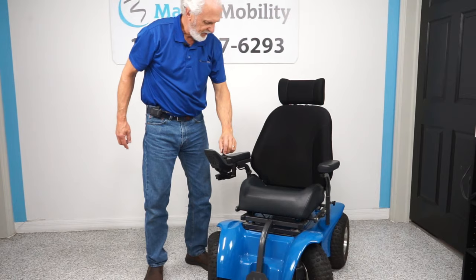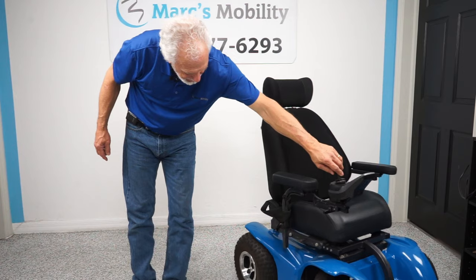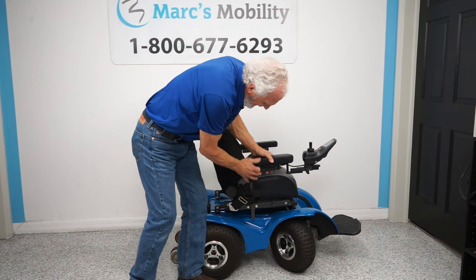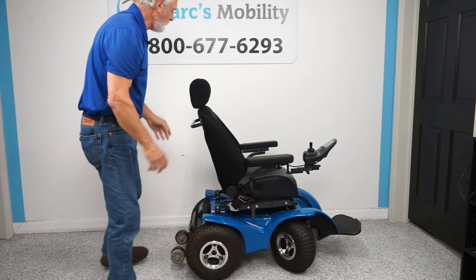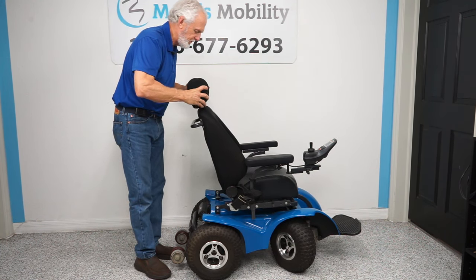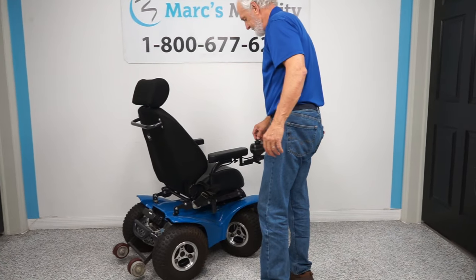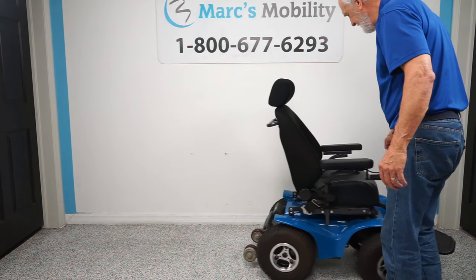The arms are fixed on this chair — they don't flip up. They do come out if you want to remove them, but they are fixed. The joystick is on the right side. The headrest isn't really functional — it's mainly for show and doesn't stay in place — but I'm not going to replace that.